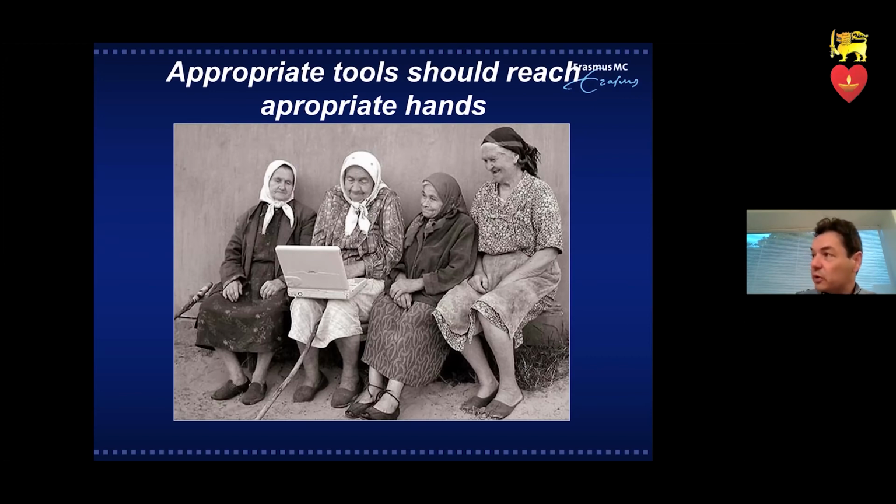That's also the second question, whether the TAP is really always protruding or people end up with a T, not so much protrusion of the side branch stent. So I cannot give you hard numbers, but the experience in European bifurcation clubs is very positive on the TAP.